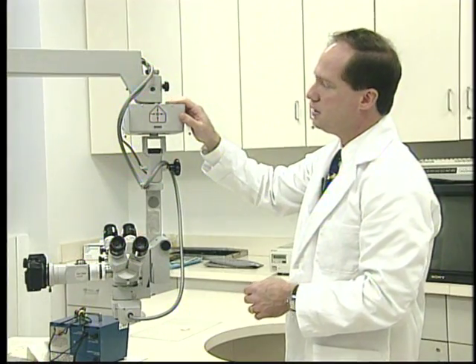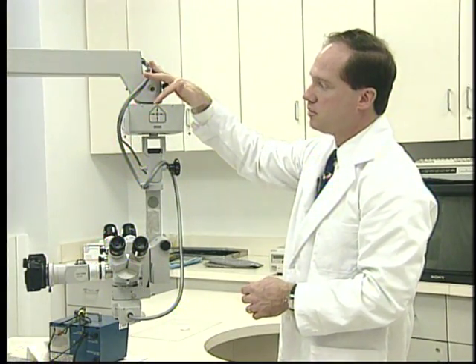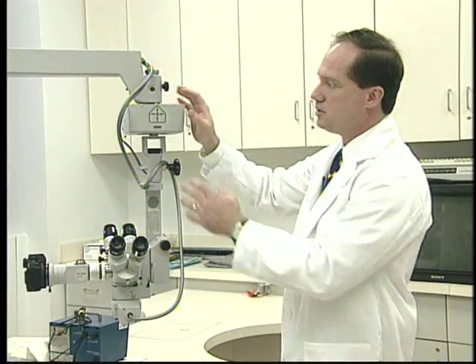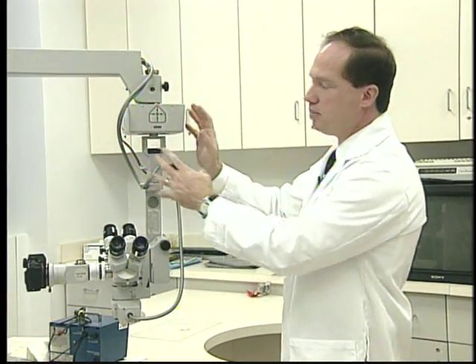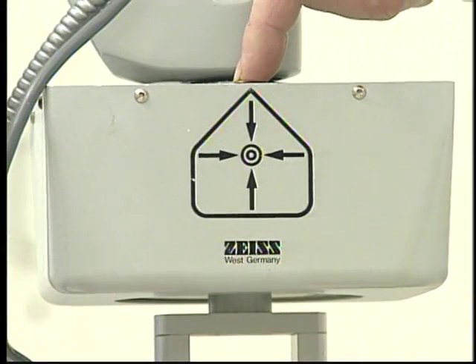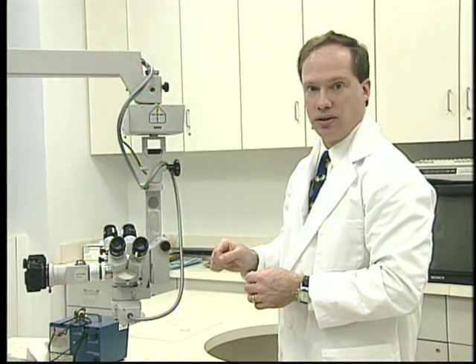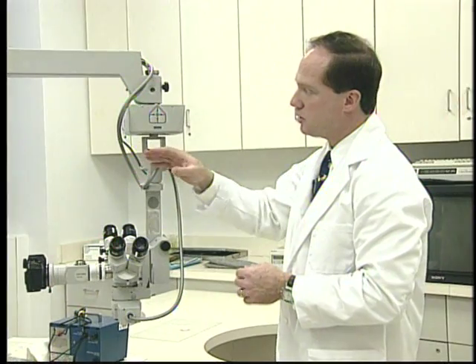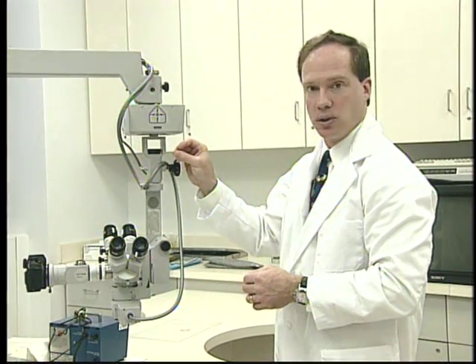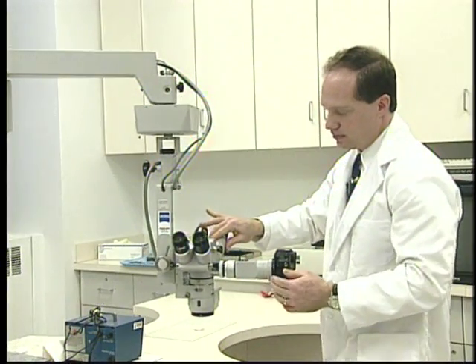On the top here, in this particular microscope, there's a little button, and many microscopes will have this button, and this is to centralize the XY position of the microscope. When you press this, and this happens to be facing to you, then this will synchronize with the foot pedal, and then when you move the foot pedal, if it's facing you in the correct position, the microscope will shift in fine movements accordingly. Let's look at the objective lens.